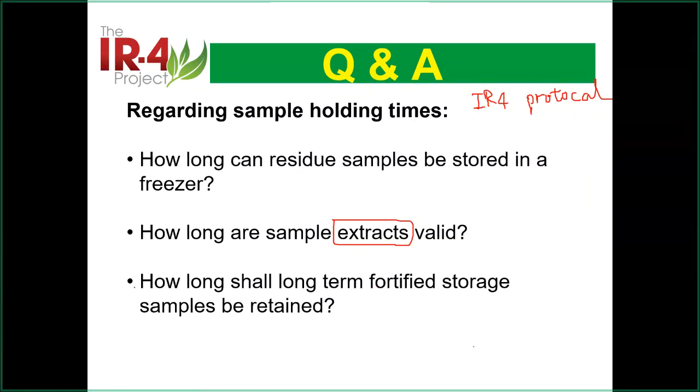The holding time in the IR4 protocol? 3 months? No. Your sample extract, I don't think this will last 3 months. IR4 protocol for general guidance is 14 days. For specific cases like bifenazate or other ones, for sure, no longer than 5 days, you have to analyze it. Because it's going to hydrolyze.